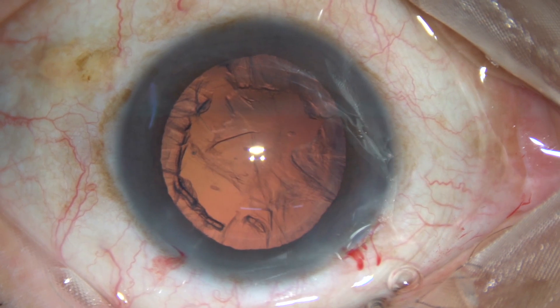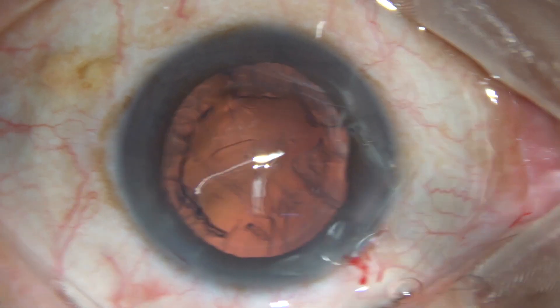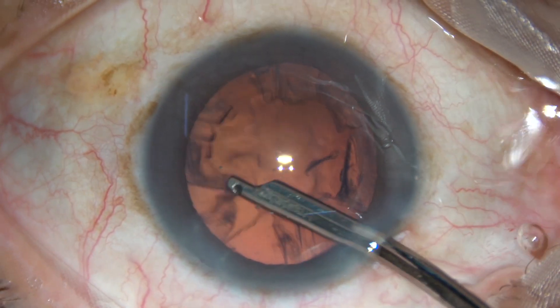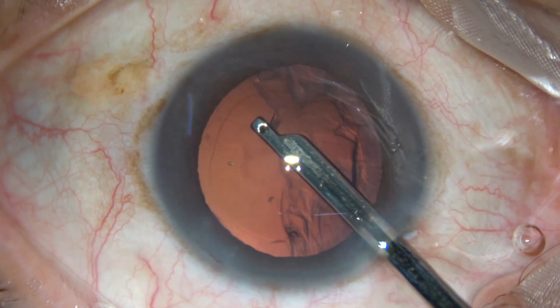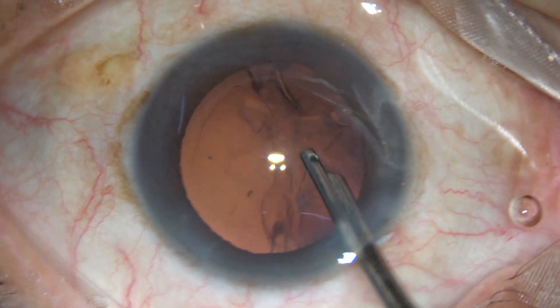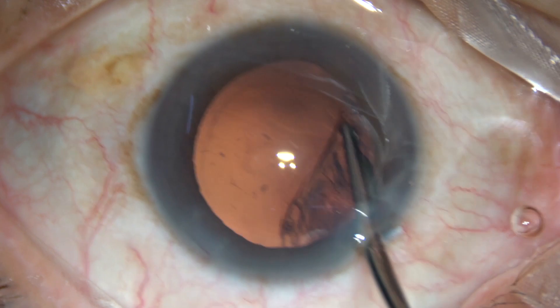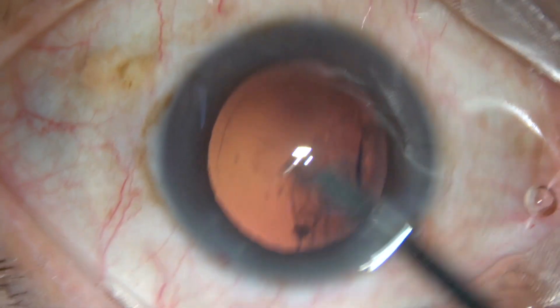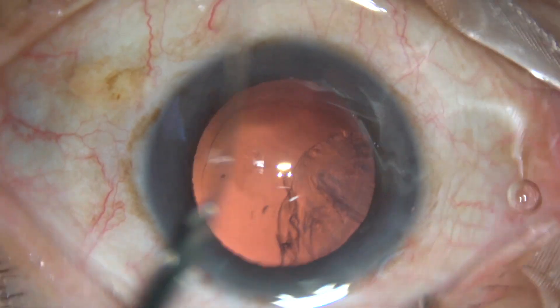There is only one side port in this case. And this is how you remove the cortex with the Simcoe cannula — 24-gauge Simcoe cannula. So within a few seconds, more than half of the cortex is removed.